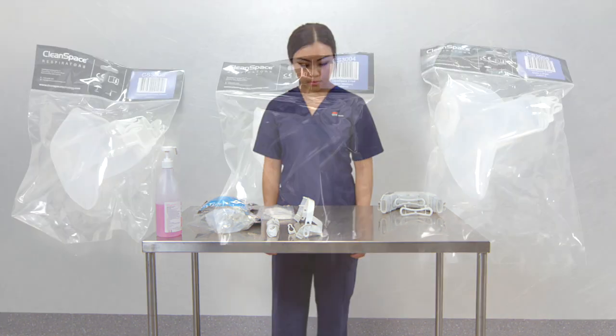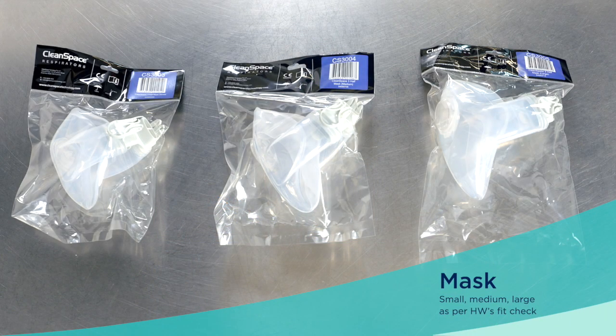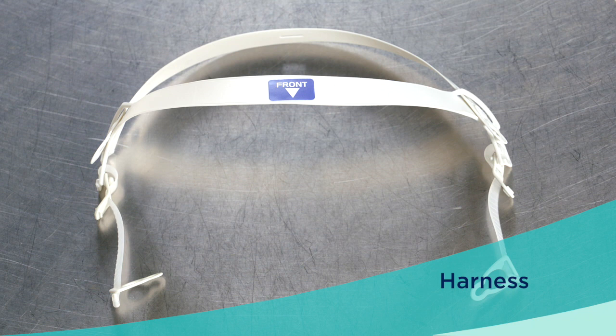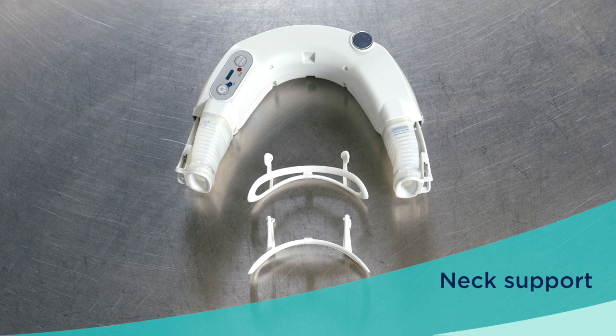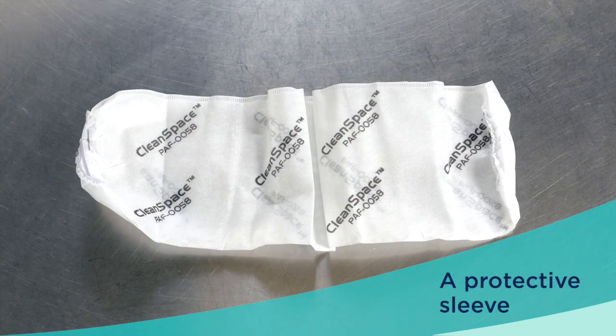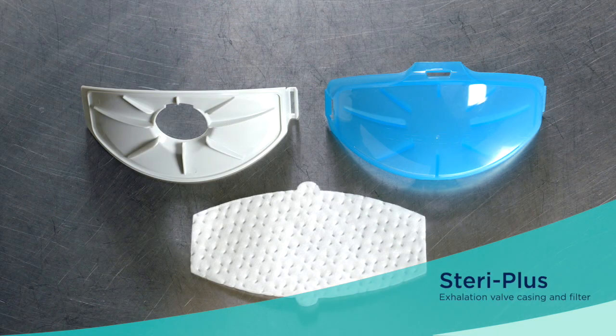To don the PAPR, you will need the CleanSpace Halo half mask — small, medium, or large based on your fit check or fit test — a harness, a power unit and filter, a neck support, and a protective sleeve. Some facilities might choose not to use a protective sleeve.